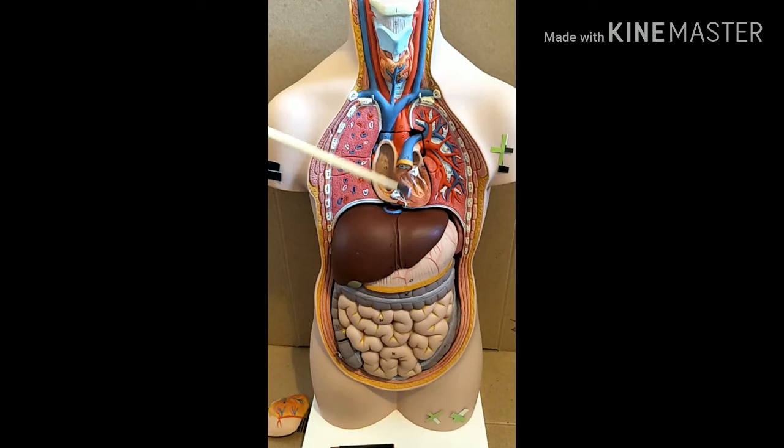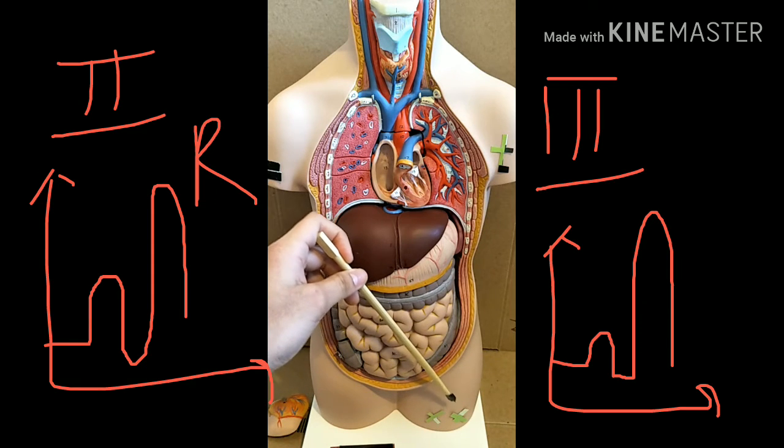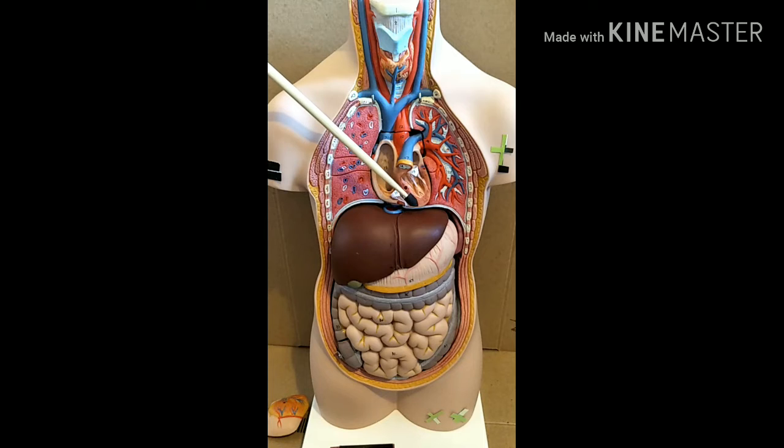So your net vector will be pointing towards the left side of the heart because the left side is thicker. As you can see, it is pointing towards the positive electrode of limb leads 2 and 3, so they will show an upward deflection as your R wave. It's a big upward deflection because the left side of the heart is thicker, so the depolarization is more, and the deflection is even more. Same as limb lead 1, it will also show an upward deflection because we are still pointing towards the positive electrode of limb lead 1.